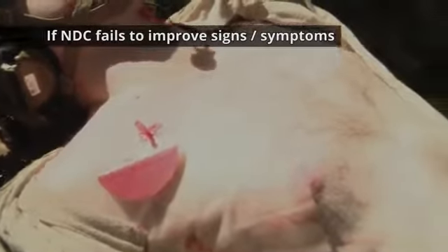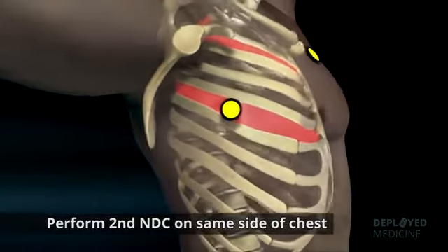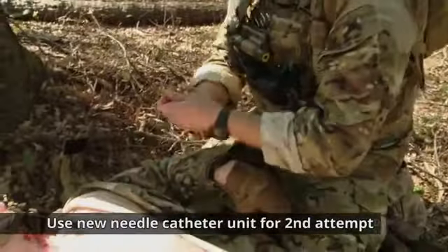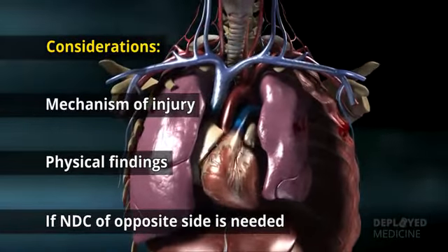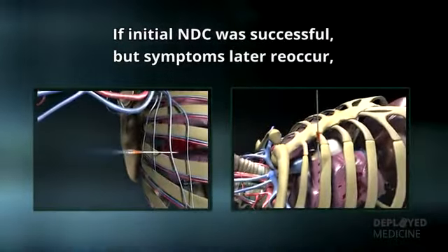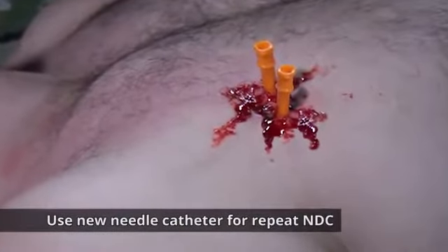If the initial NDC fails to improve the casualty's signs or symptoms from the suspected tension pneumothorax, perform a 2nd NDC on the same side of the chest at whichever of the 2 recommended sites was not previously used. Use a new needle catheter unit for the 2nd attempt. Consider, based on the mechanism of injury and physical findings, whether decompression of the opposite side of the chest may be needed. If the initial NDC was successful but symptoms later recur, perform another NDC at the same site that was used previously. Use a new needle catheter unit for the repeat NDC.